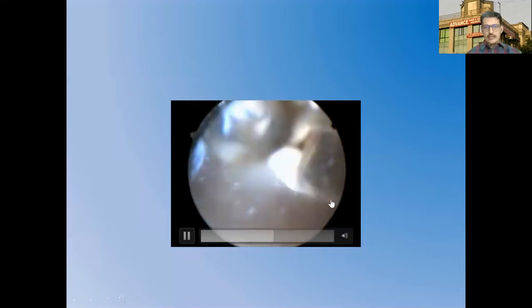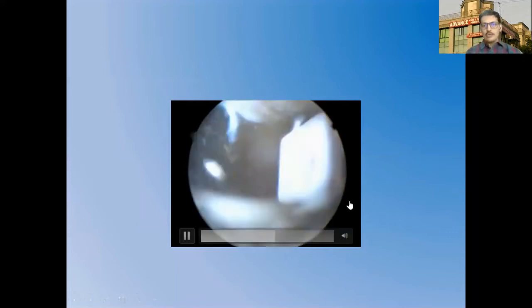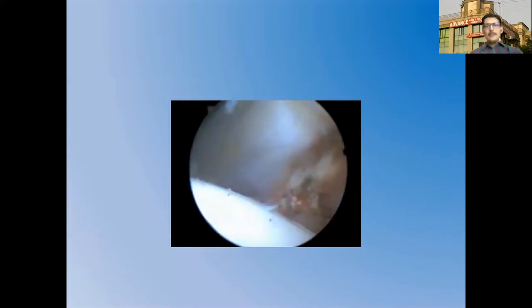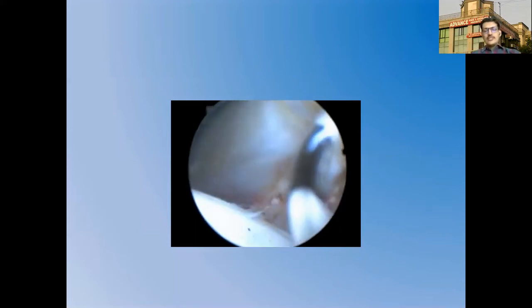Once the calcium deposits are removed, the next step is to address any FAI problems. This was a young patient of about 30 years of age, so extensive cam osteoplasty was not performed, but labral repair was planned since the labrum was clearly pathological and was the likely cause of these calcific deposits. Thorough removal of all calcium deposits is mandatory.